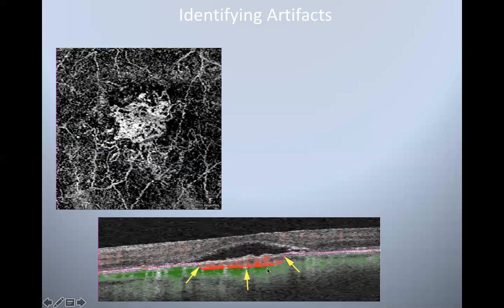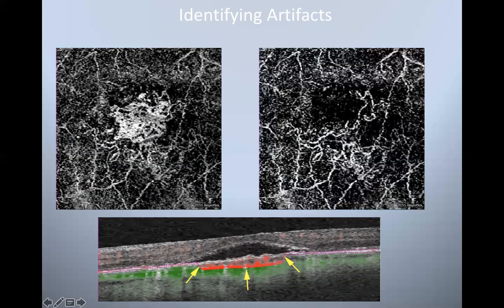So it's important that you look at the segmentation lines and make sure it's actually giving you the image that you really want, and not giving you some sort of false information. When I took that out and did a scan right there, below the RPE at the choriocapillaris, before I started picking up all these, you can see these are choriocapillaris vessels in here. Here's the actual neovascular complex. It's a very new, early neovascular complex growing out here. So it's really not as big as it looks on the left-hand side. So this is another reason to look at this OCT flow pattern, B-scan flow patterns.